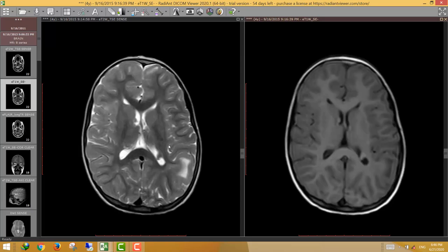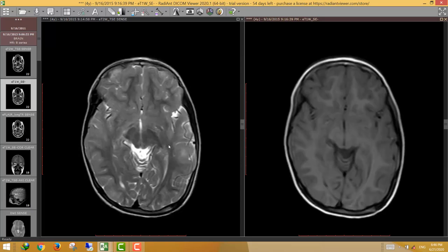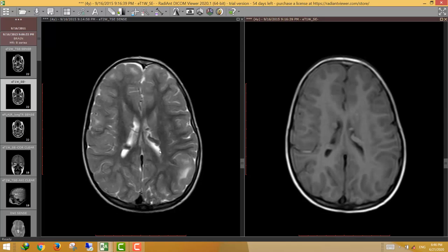So these nodules are likely tubers of tuberous sclerosis. In the subependymal tubers of tuberous sclerosis, we should measure the largest nodule, because if the nodules increase in size, this may indicate potential neoplastic transformation to what is called subependymal giant cell astrocytoma (SEGA).